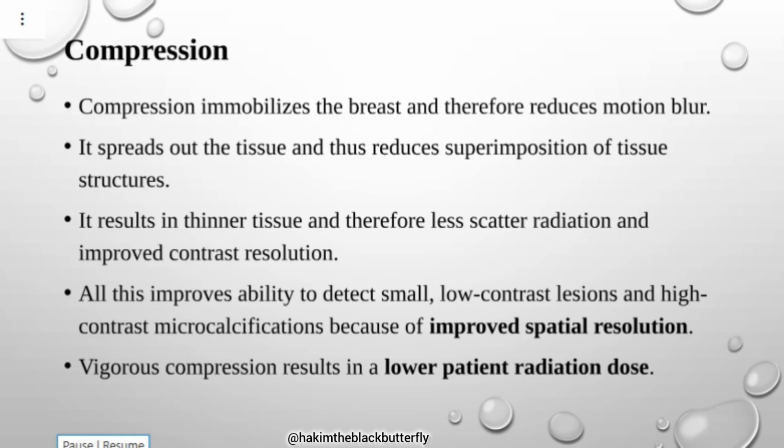So remember, when you're standing, you will never stand still like an electric pole. Even if you're standing, you're always wobbling around, trying to balance yourself and remain still, but you can never be still. So when the patient is standing and you have put a breast on the breast support, the breast will always be moving around. We don't want that. I was talking about motion. When you're standing, you can never be still.